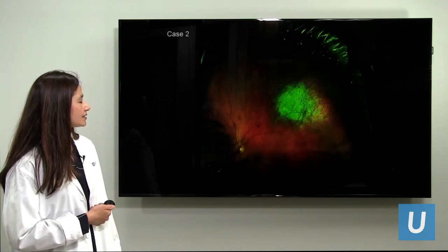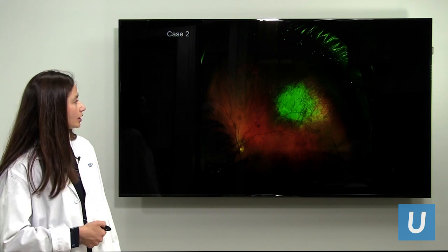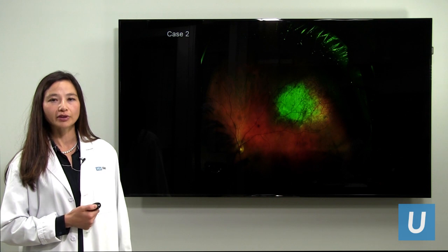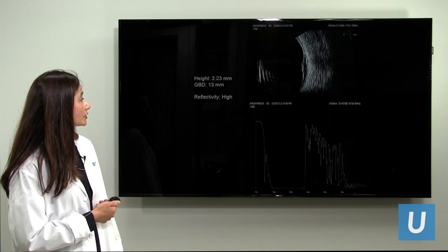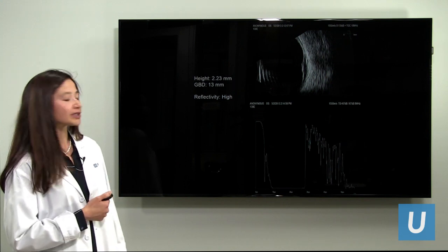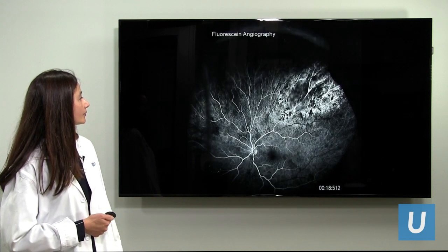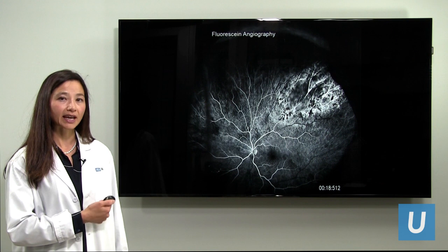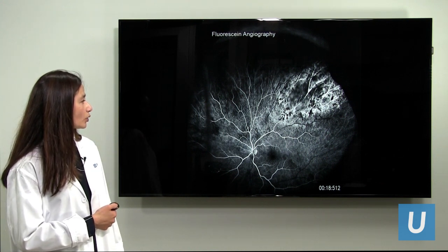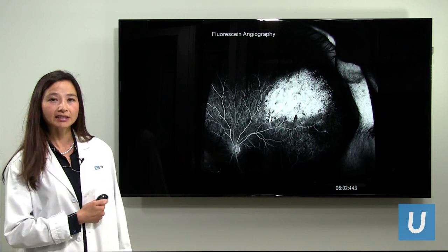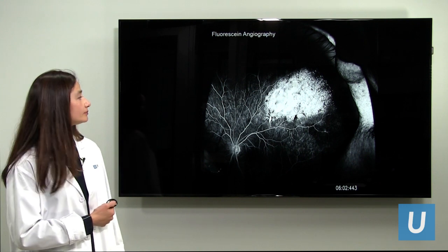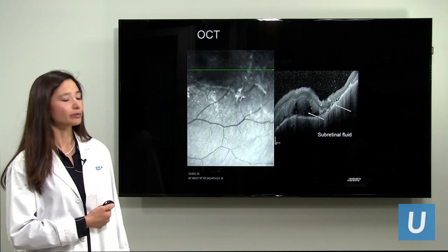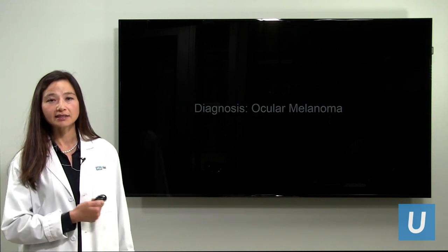Here is another case: a young man followed for quite some time with a scar-like lesion with a little bit of pigment. Over time the lesion wasn't going away and was very unusual. Ultrasound shows the thickness and reflectivity patterns through the lesion. Fluorescein angiography reveals an intense amount of activity with abnormal vessels leaking. The OCT scan shows subretinal fluid associated with the tumor. The diagnosis in this case is also ocular melanoma.